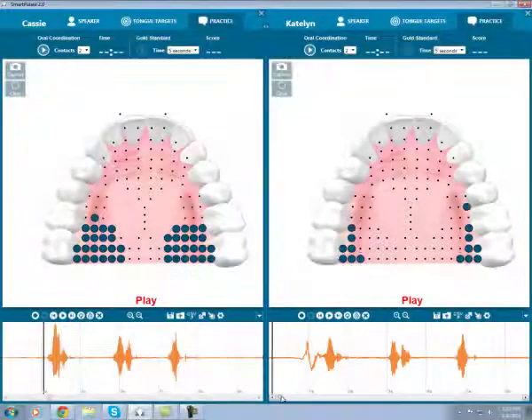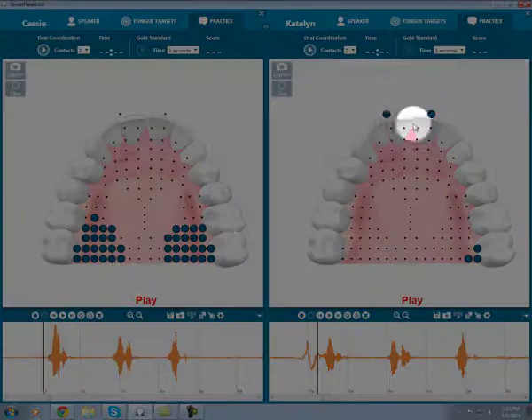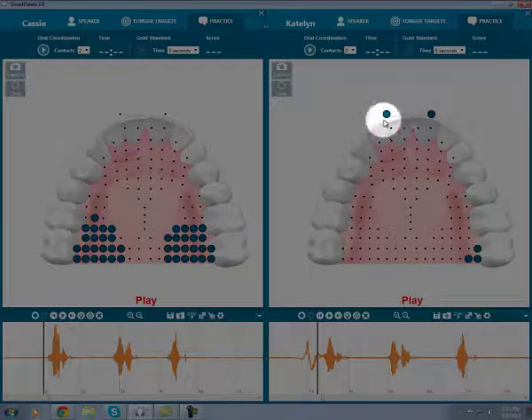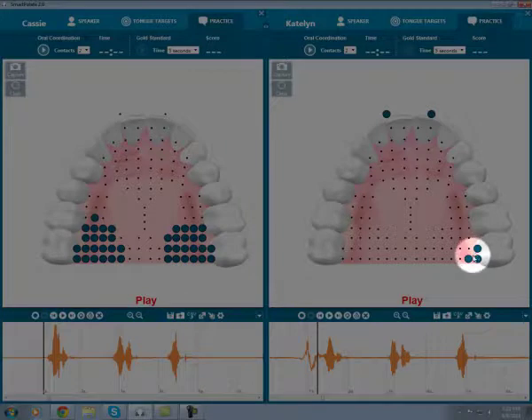On Caitlin's side, we can look at the beginning of her word, wabbit. You'll see that her lips were rounded, activating the lip closure sensors. She started to have some tongue placement near the back molars, but not enough to successfully make the R sound.